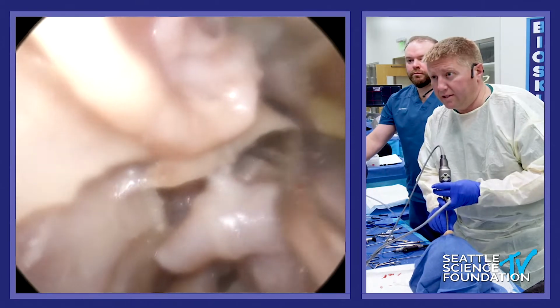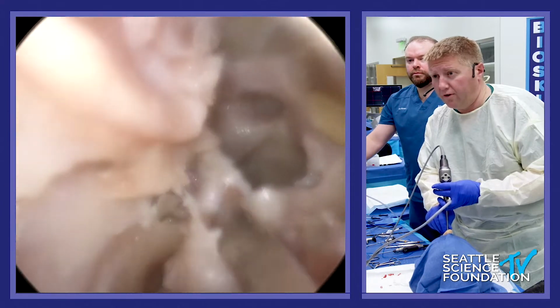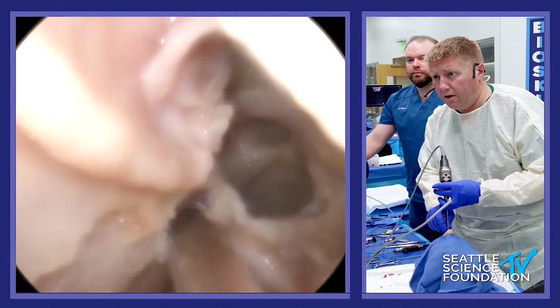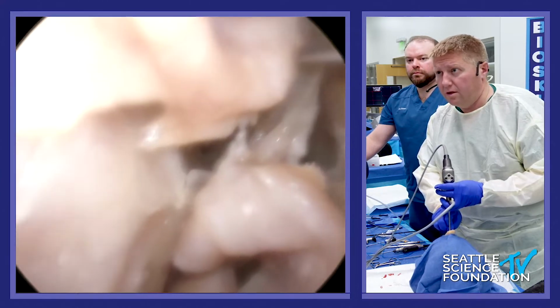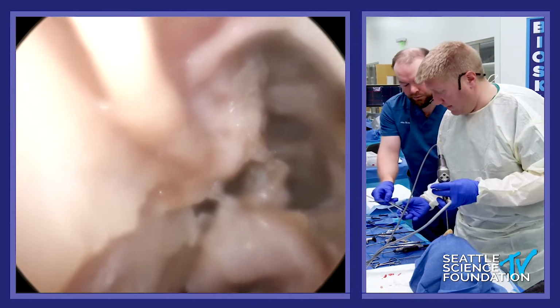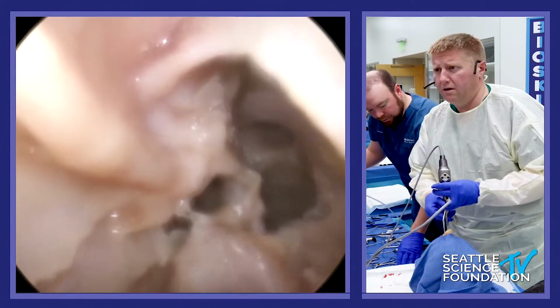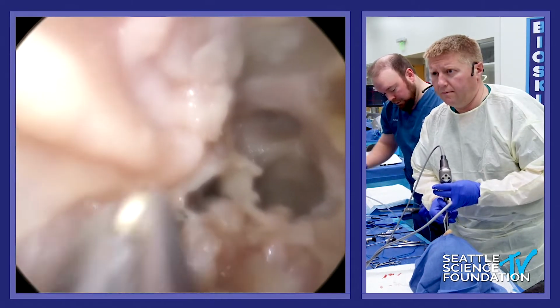This is a really nice flap that can be used for skull-base reconstructions, for pituitaries, a lot of different utilizations of this. And I'll take that scissors back, please. Thank you. There we go.